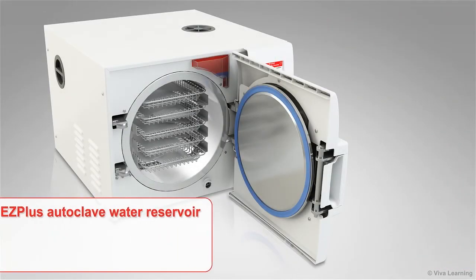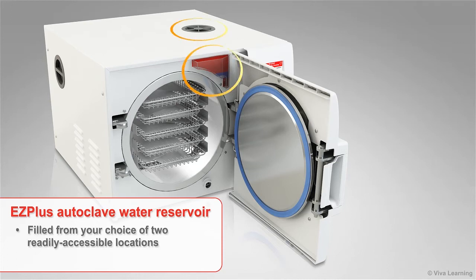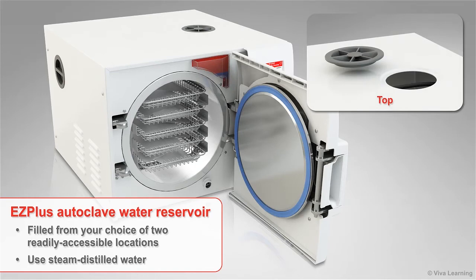Also new to the EZ Plus series of fully automatic autoclaves is a water reservoir that can be filled from your choice of two readily accessible locations. Either pour the steam-distilled water into the convenient EZ-Fill front-fill funnel located on the front of the autoclave, or pour steam-distilled water through the opening at the top of the unit.